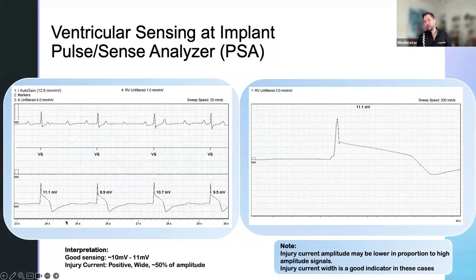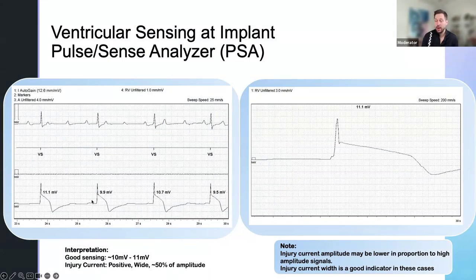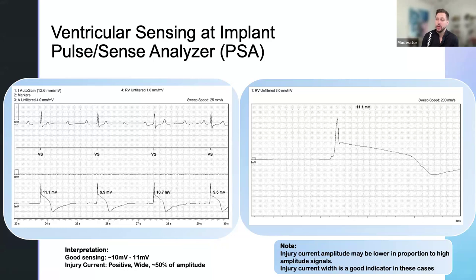The reason I'm showing you this is I think it's really important to understand what you're looking for when you first connect to the PSA — what you're looking for as far as indications of good lead connectivity, whether or not the lead is in the right place where it's supposed to be, because you can't always tell fluoroscopically. It can also indicate whether or not you could have a perforation.